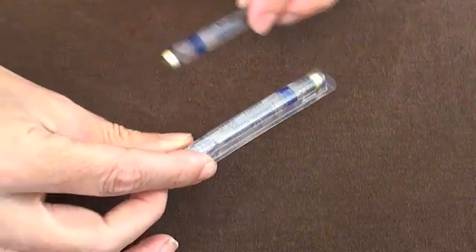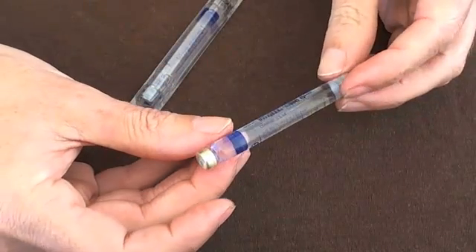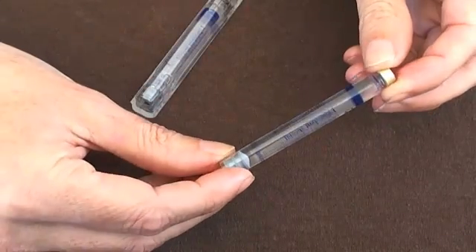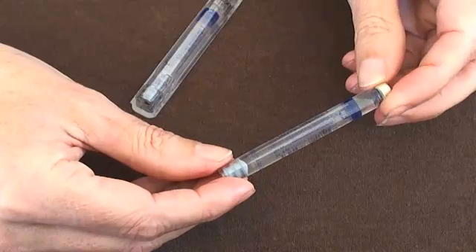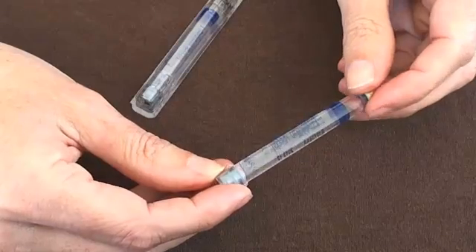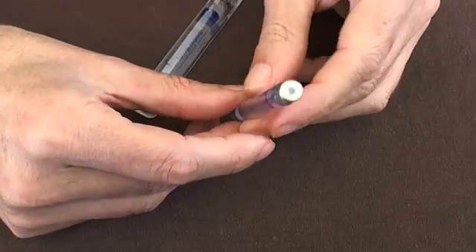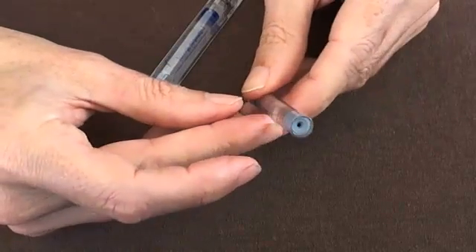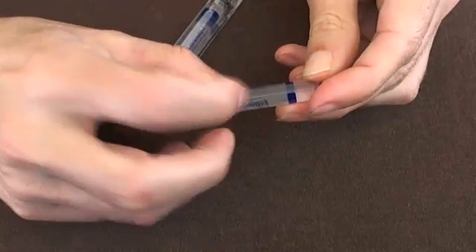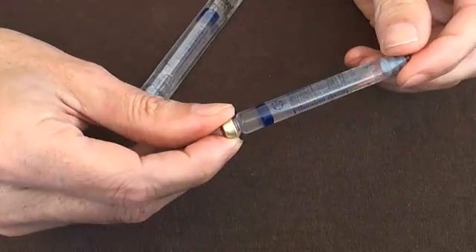Once you remove it from its packet, the carpule looks like this. There are a few key features to a carpule. The first thing is that it contains just over 2ml of solution, and all dental carpules are preset with about the same volume. It has an end with a gold or metallic-looking end to it, and the other end has this sort of rubbery-looking end to it. The actual carpule itself is made of glass and it has a bunch of writing on the surface of it.